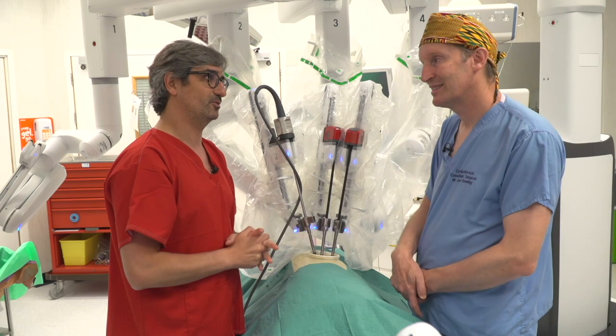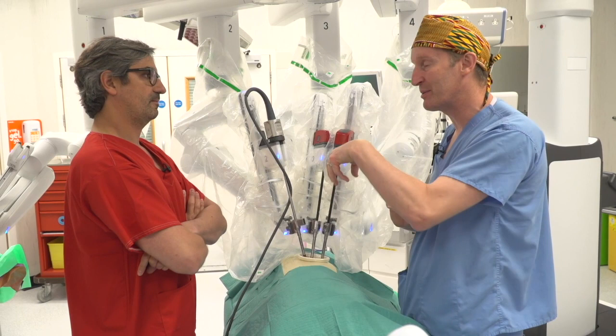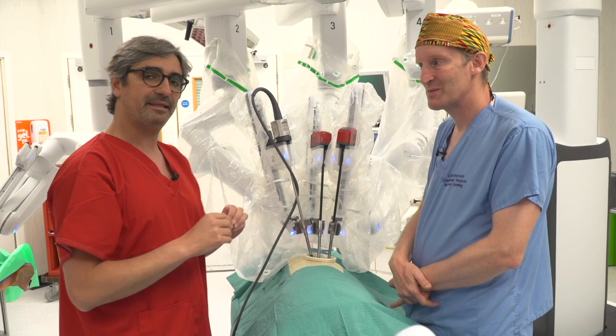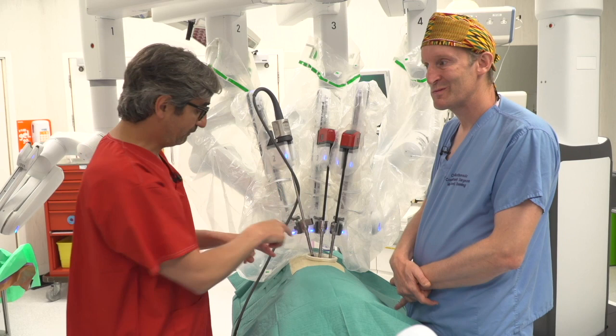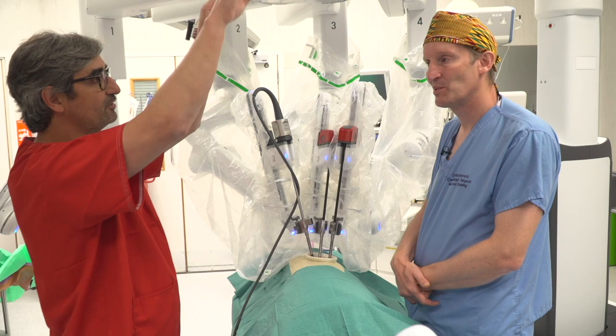Yeah. And one tiny thing, we're just using a zero camera for this demo because we need to save our 30 for the case this afternoon, but it's 30 down, isn't it? And that's the key to actually being able to not have any clashing. Exactly. That's an important part. We always keep the 30 down, like in uniportal VATS, but there are some tricks. For example, what happens in case of adhesions? You have a lot of adhesions and you have to reach the apex, or the anterior part, which is here, or the posterior part, then you can switch and put the 30 up and then you can release the adhesions easily.